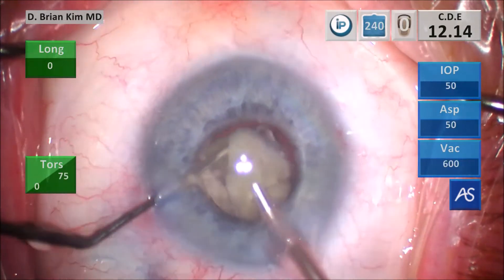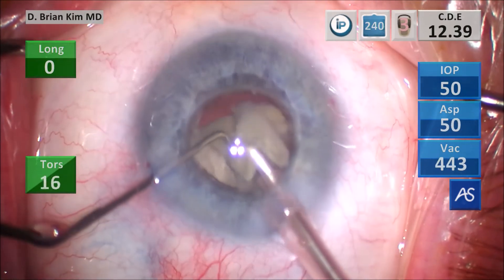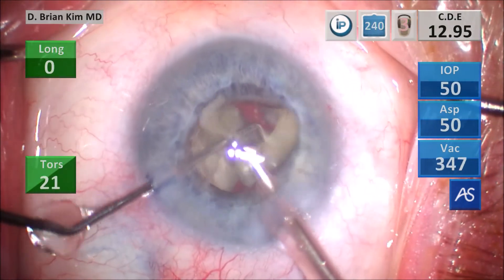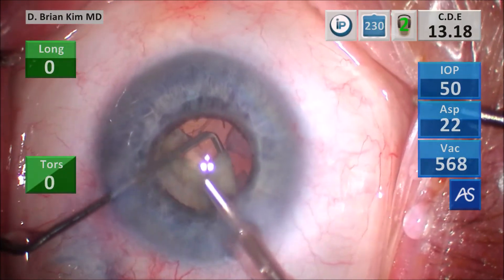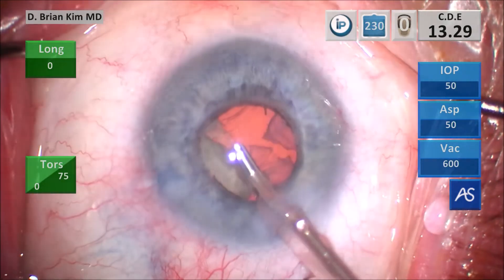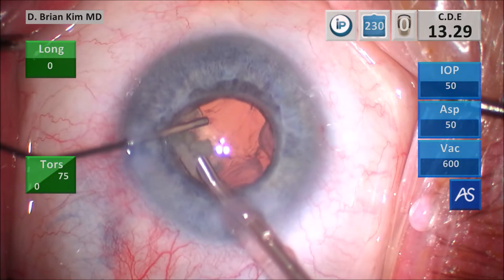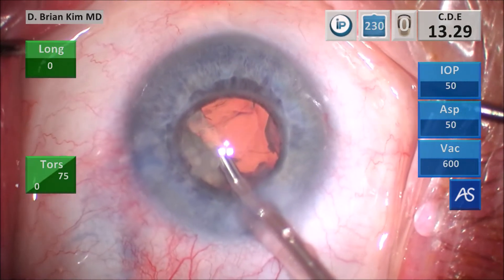This is the key: make sure you bring the pieces up to your phaco tip and then start vacuum. I did this somewhat successfully — you're going to see when I didn't do it successfully. Right here I'm doing a good job making sure those pieces are right at my tip and I'm emulsifying those lens pieces very well. Everything's going great. This is where I made a mistake — I went after it with vacuum and ate all that OVD. You saw the posterior capsule defect kind of move suddenly, and that is not the way to do it. I should have hooked that lens piece up with the chopper.